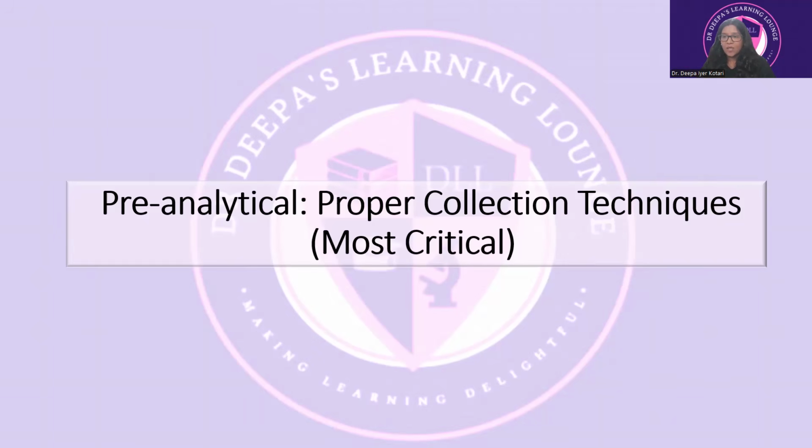And in such cases where you know that the patient is undergoing hemolysis, let's say due to a heart valve or because of any other type of hemolysis where it is unavoidable, you still want to give out the report. In such cases, you should pick up the phone, tell the clinician that hemolysis can cause interference in these parameters, and you need to look at these with caution.